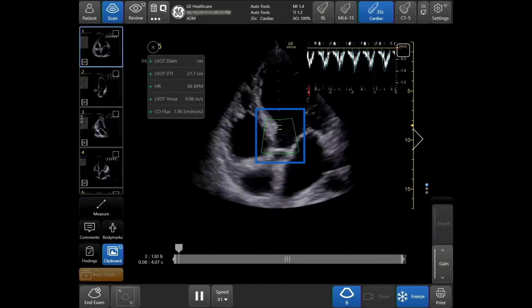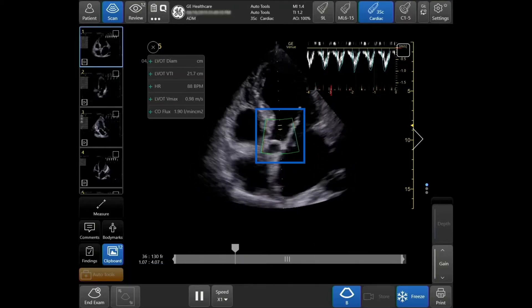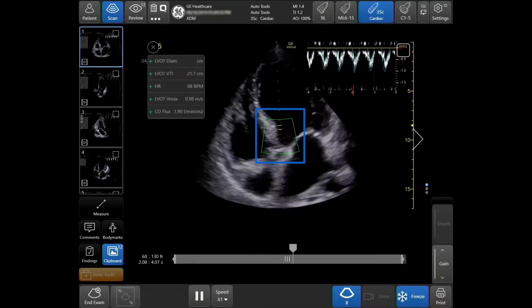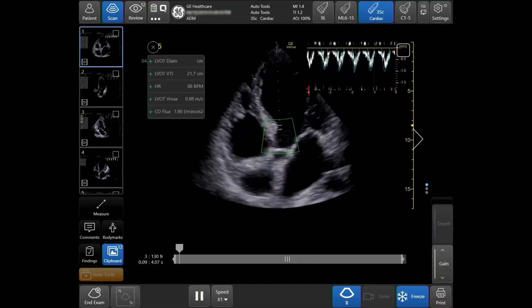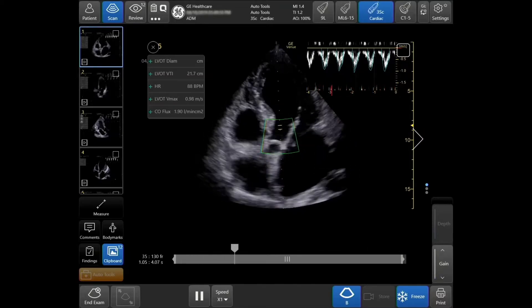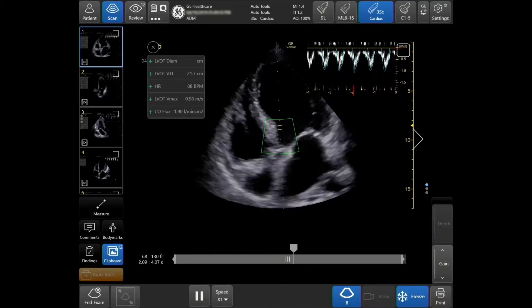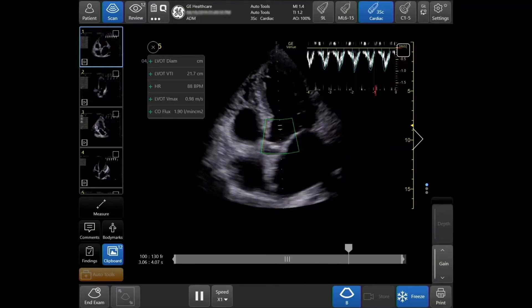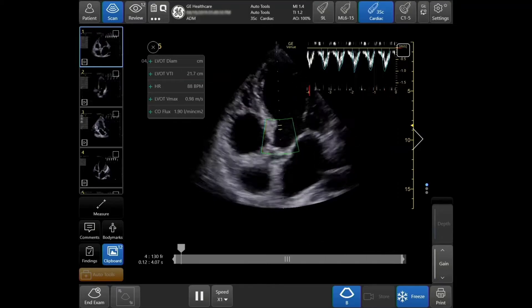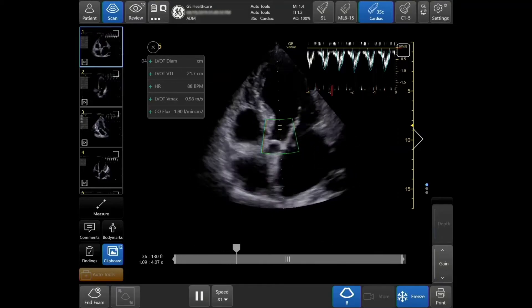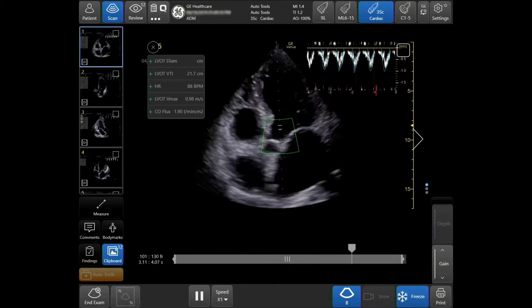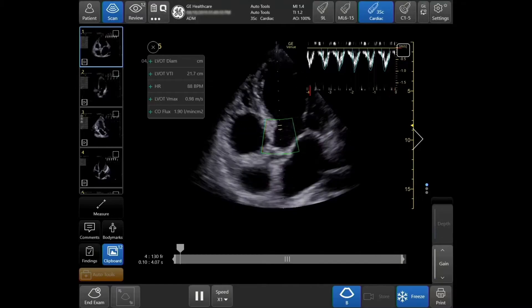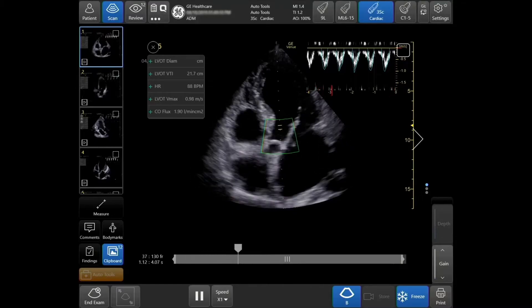Your quality indicator will now be displayed. When green, the results are highly likely to match calculations created by an expert. When yellow, the results should be taken with caution. When red, no results are shown on the system.